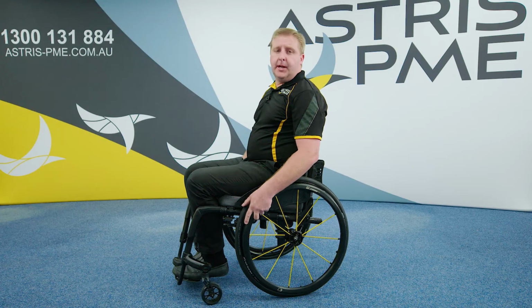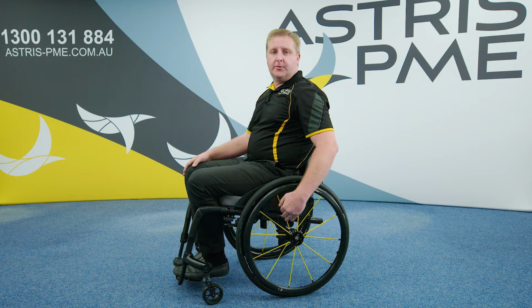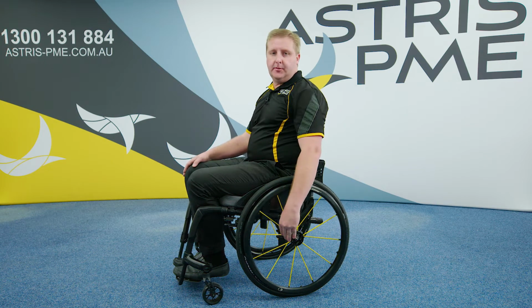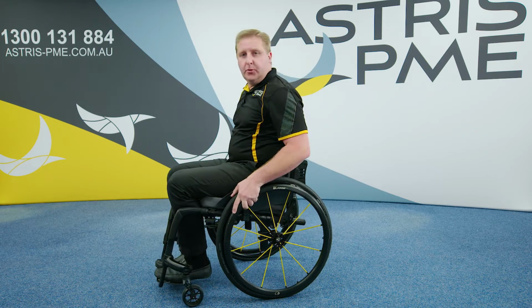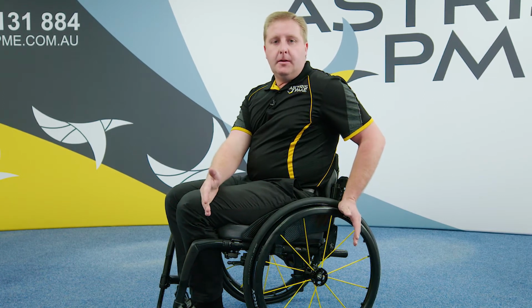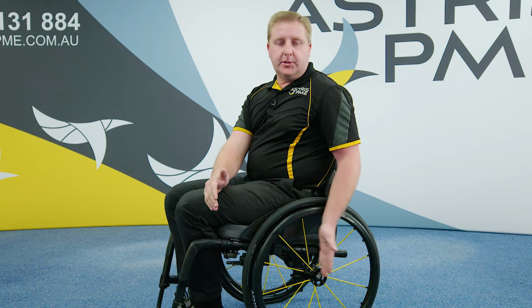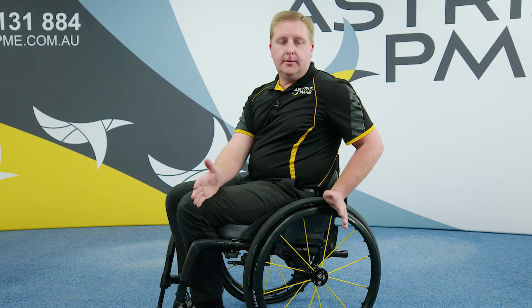Where possible, the axle should be in a straight line with your centre of gravity over the axle, from your head to your shoulders down to your axle, which enables the chair to be tippy and easy to push. Most manufacturers of wheelchairs have the ability to have different length frames. This, coinciding with your adjustable centre of gravity, enables the wheelchair to be shorter or longer.